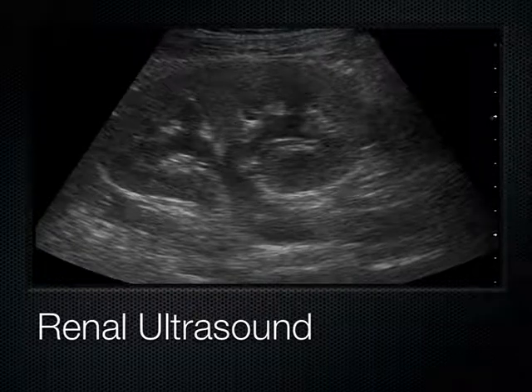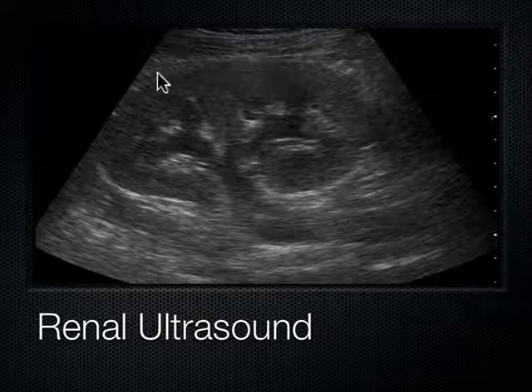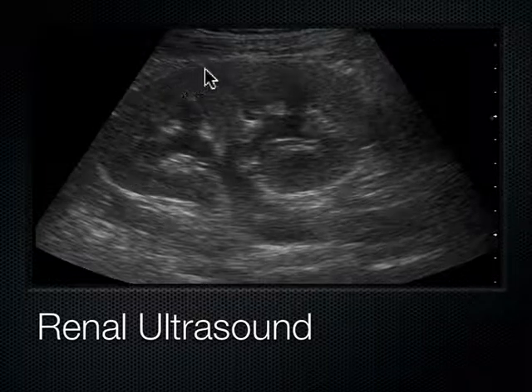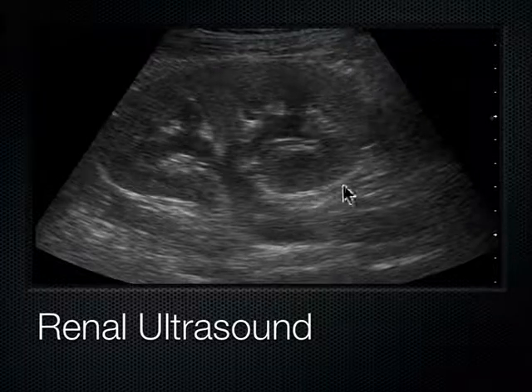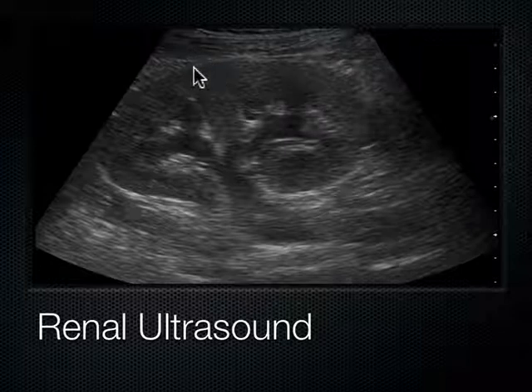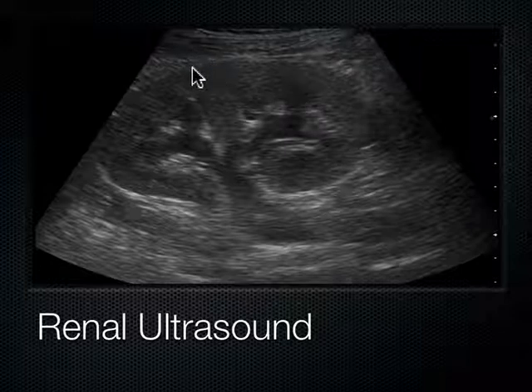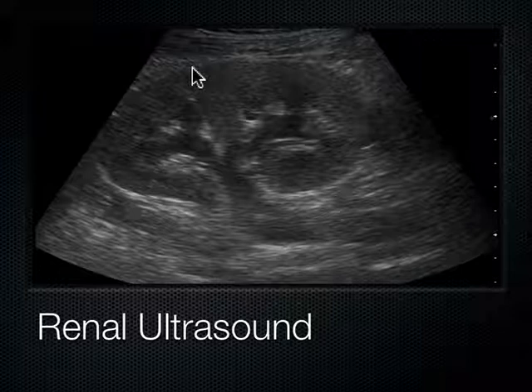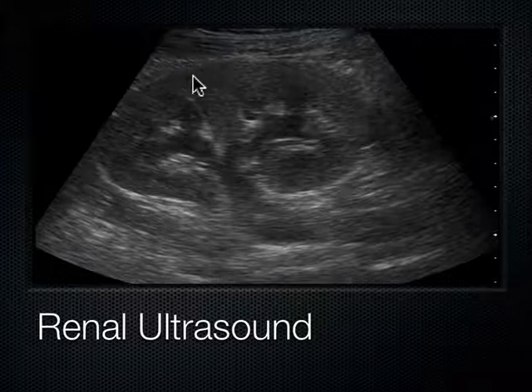You can tell from this image right here — this is a kidney. The kidney has some anatomy to it. This is the capsule of the kidney out here. It's a very thick fiber structure and the capsule does not allow the kidney to expand very much. So when somebody has a blockage like a kidney stone, there's nowhere for the kidney to expand, and that's why people get excruciating colicky pain — it's because of this capsule, this thick structure out here.